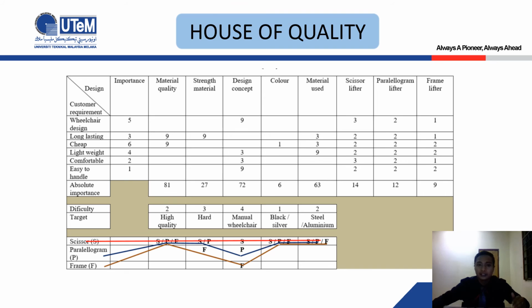After all the criteria have been given their weight and calculated, we can see the result in the line graph below. Scissor lift has the highest ranking and the most stability, always on top of the line graph. So that means the scissor lift is the best design and achieves all the requirements needed by a user.